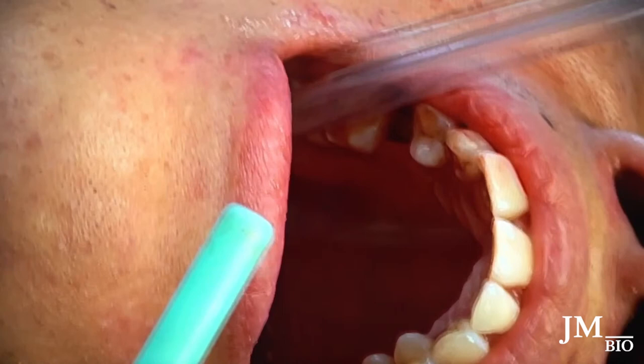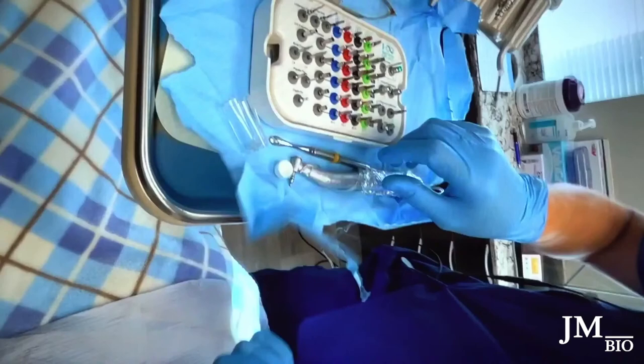So it's on the implant. Make sure it's on the slow setting — never on the fast setting when you place your implant. Always slow it down really well and grab the implant. It's a 4x10. You'll notice the sterilized foil on the handpiece — you can't sterilize the motor part, so you sterilize the handpiece attachment and wrap sterilized foil around the motor to keep it sterile.